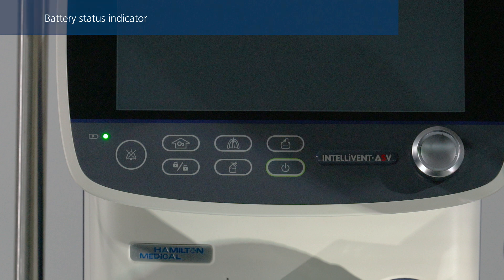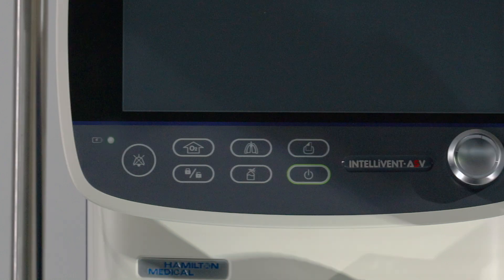When the indicator is solid green, the battery is fully charged and connected to primary power. If the battery is not charging for whatever reason, the indicator will remain dark. Make sure the ventilator is connected to a power source prior to starting ventilation.